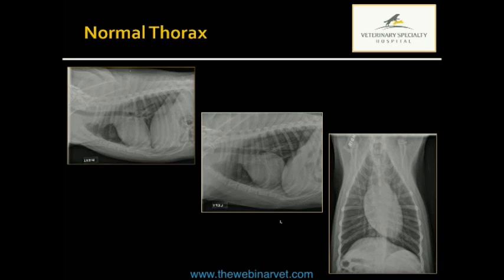White already went through evaluation of abdomen with you, so with the same level of detail and thoroughness, even though you have a limited portion of the abdomen, you want to do the same thing, serosal detail, organ by organ, whatever you have. You want to make sure you evaluate that.